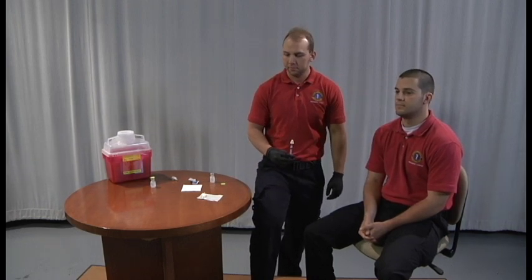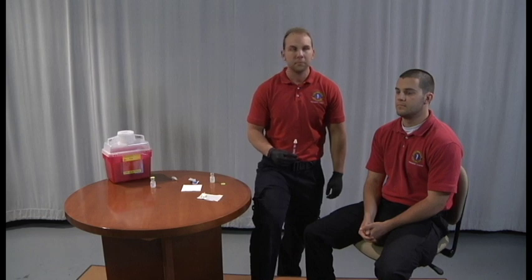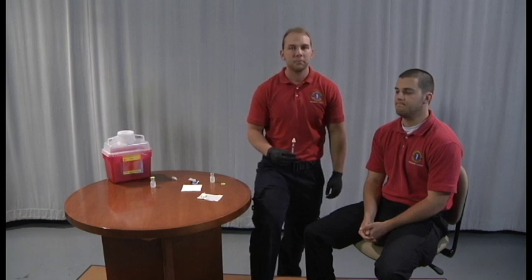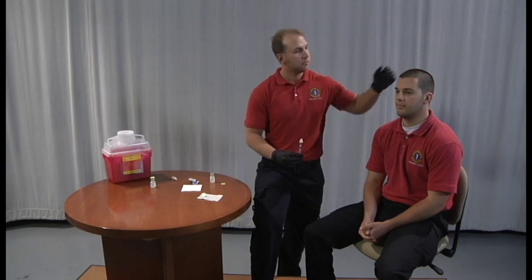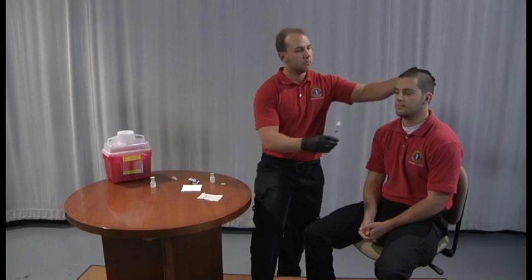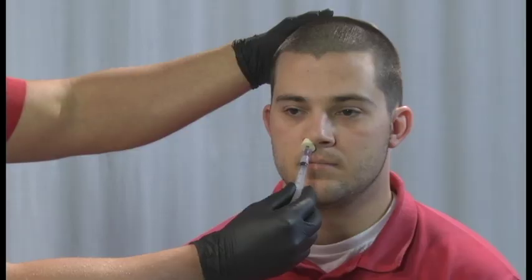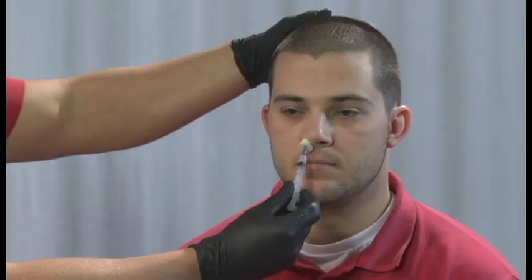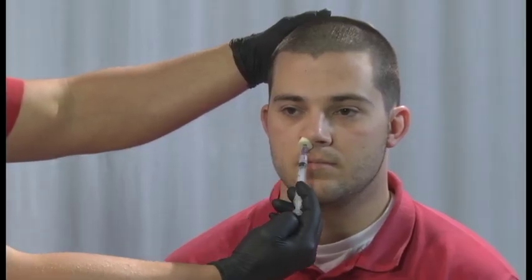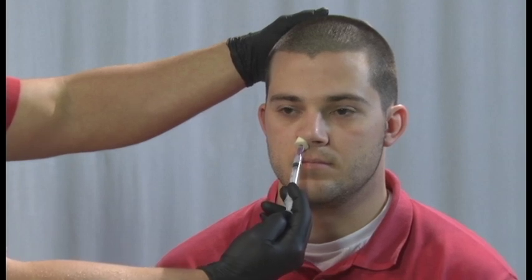If an obstruction is present, suction the nostril or consider an alternative medication route. Using the free hand, hold the head stable and place the tip of the device snugly against the nostril. Aim slightly up and outward toward the top of the same side ear.